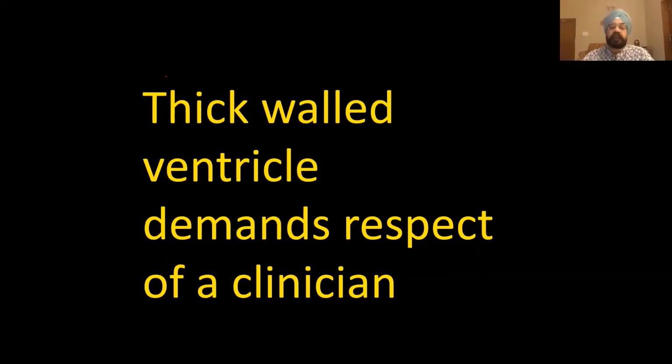So there are two questions. I think you need to give a quick comment. What is the meaning of a neutral curvature? And secondly, sir, how do we make assessment of diastolic function in HCM? Is it different than usual heart failure with preserved ejection fraction? So the diastolic dysfunction actually is no different. It is absolutely the same. The only thing you need to remember is that in typical hypertrophic cardiomyopathy, the septal S prime has multiple fragments, and E prime is severely reduced, and it does not correlate with filling pressure that much.